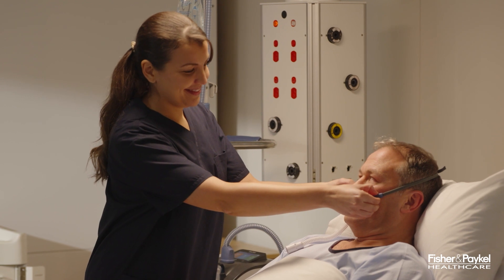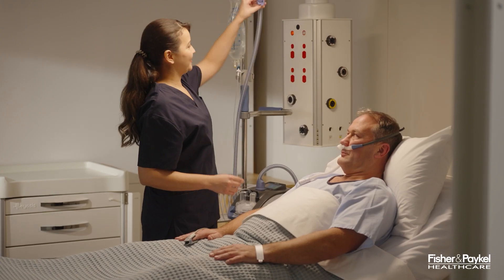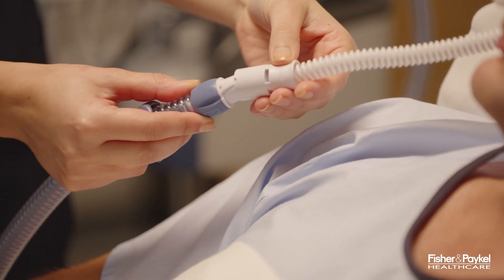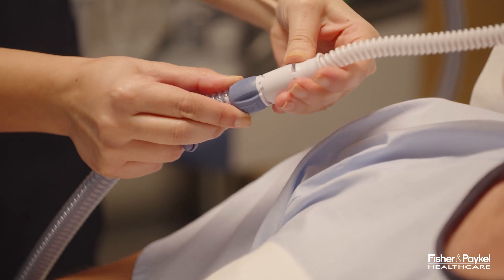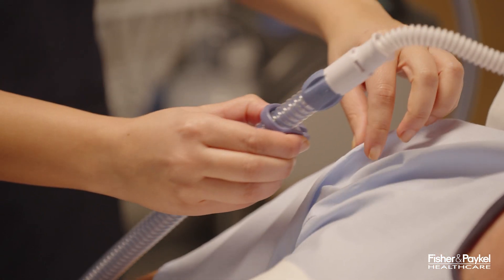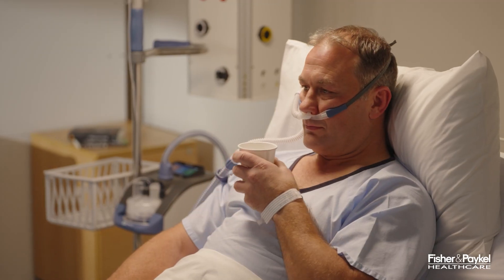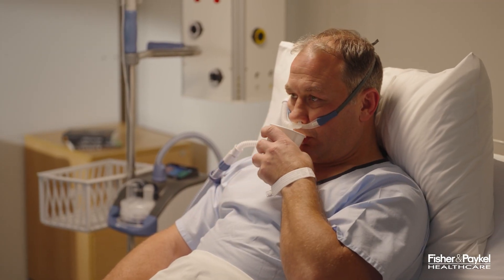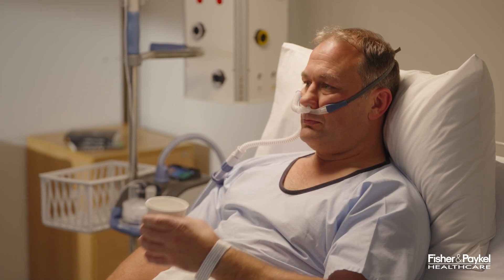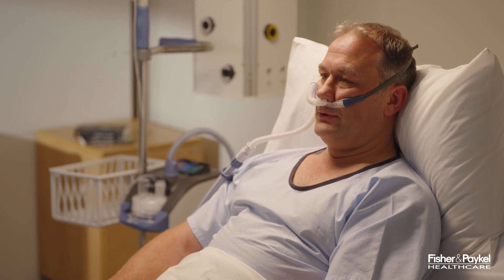Fit the interface to the patient following the user instructions supplied with the interface. Connect the patient interface to the breathing tube and attach the breathing tube clip to the patient's clothing. The gas may feel warm when the patient first puts on the therapy — this is typical; they should simply continue to breathe normally.